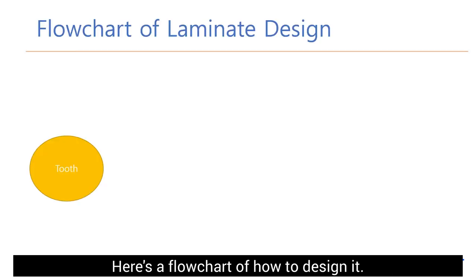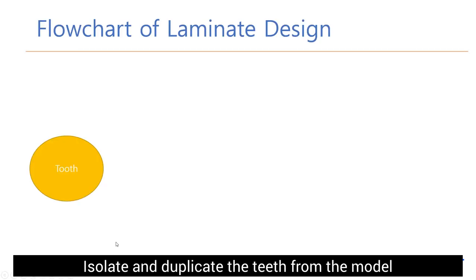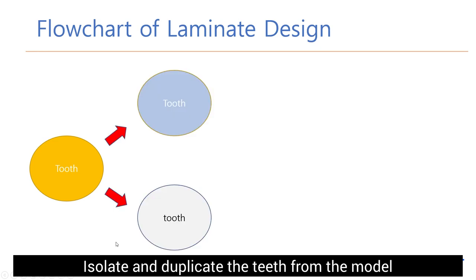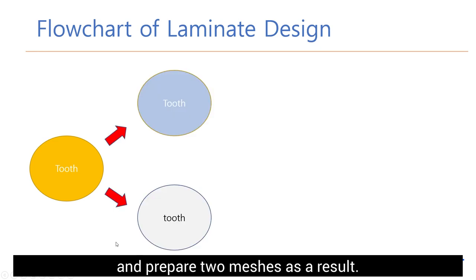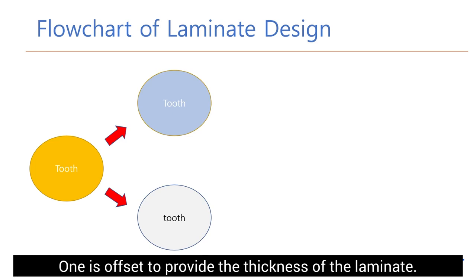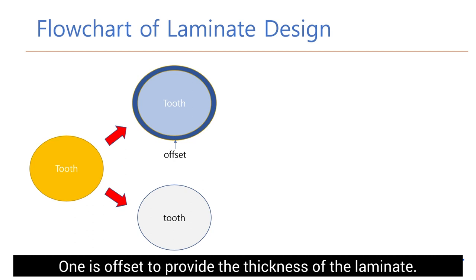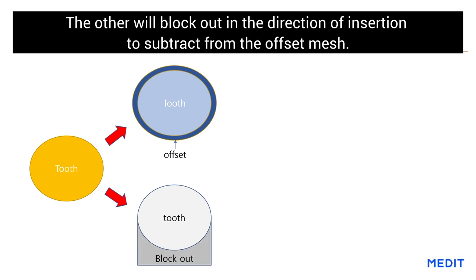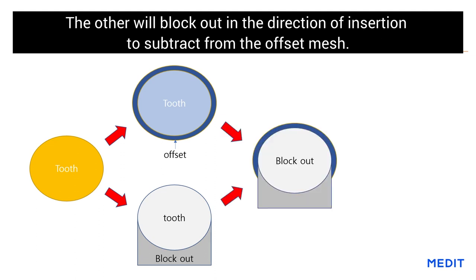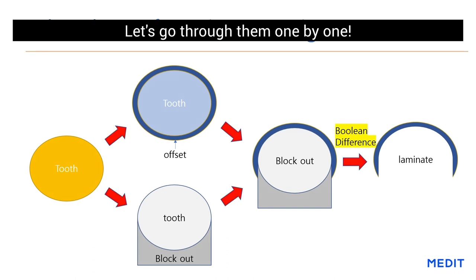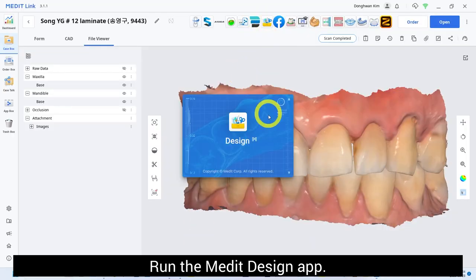Here's a flowchart of how to design it: isolate and duplicate the teeth from the model and prepare the mesh. One mesh is offset to provide the thickness of the laminate; the other will be blocked out in the direction of insertion to subtract from the offset mesh. Let's go through them one by one. Launch the Medit Design app.